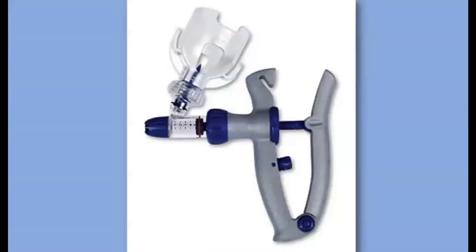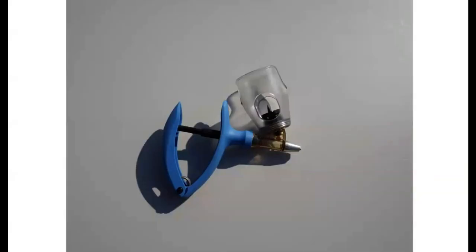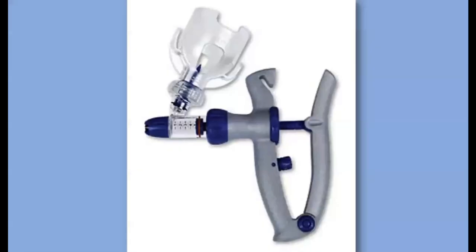The other thing I should mention on this previous one is you do have to be mindful that some of them that the bottle attaches to don't have any kind of adjustment. So make sure you buy the dosing volume that you need. And also it only fits certain size bottles. So let's say you had to work 70 head of calves, and so you bought one 50-dose bottle of Clostridial vaccine and two 10-dose bottles. Well, the 10-dose bottles are probably going to fit on here, but that 50-dose bottle won't. And so that's something to keep in mind with this style versus the barrel style.